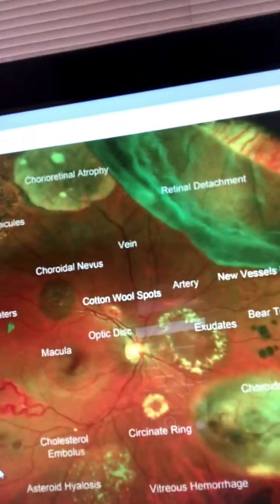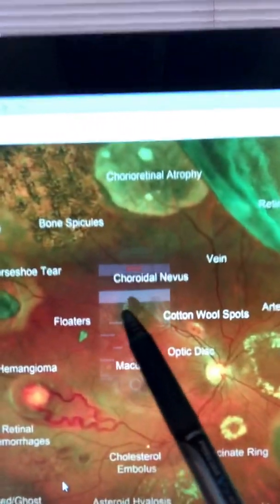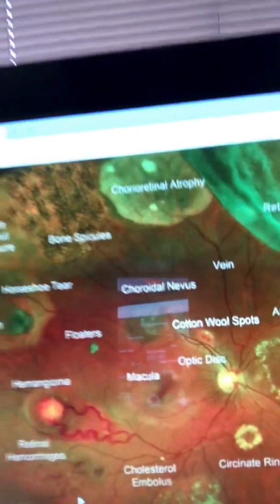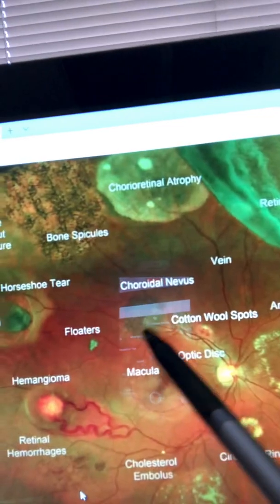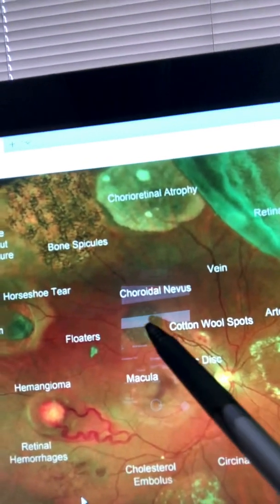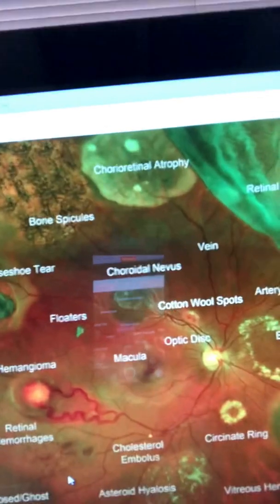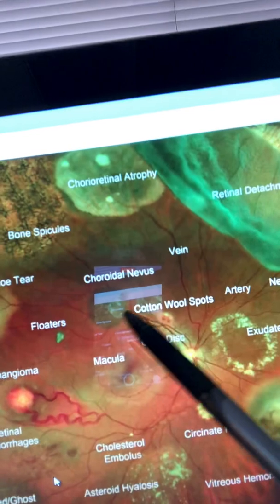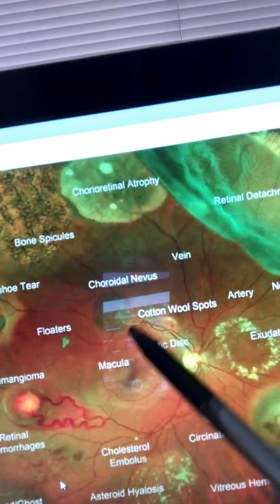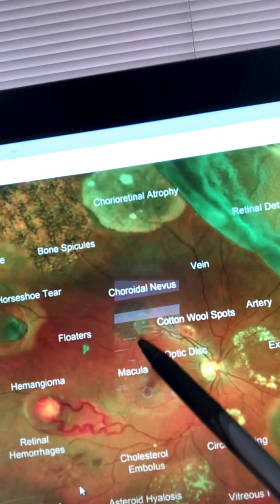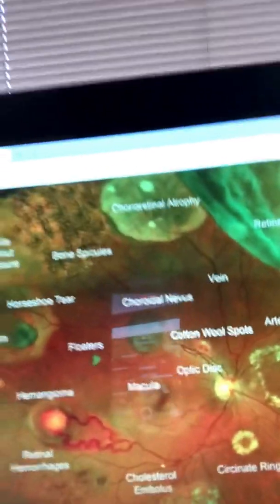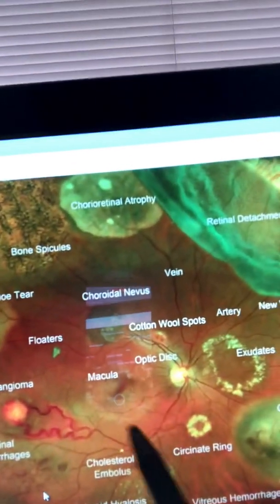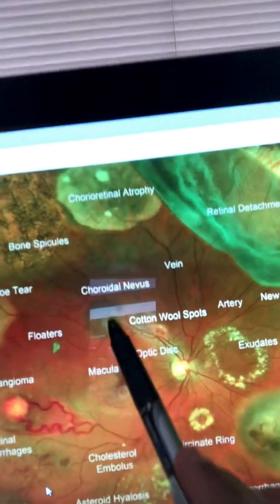Then, commonly seen, is a choroidal nevus — right there. This is a benign mole or freckle, as we call it in layman's terms. We have to document it; without a picture we cannot see how big it is, whether it's changing in size, if its margins are defined or irregular, whether it's elevated or flat, or if there's any pigmentation. We need that picture for proper documentation.